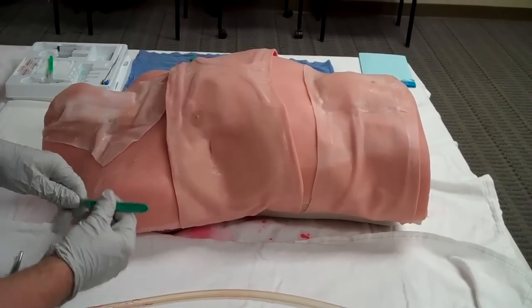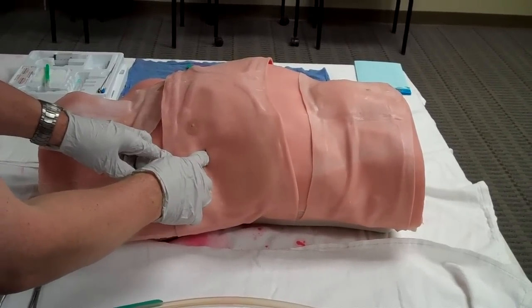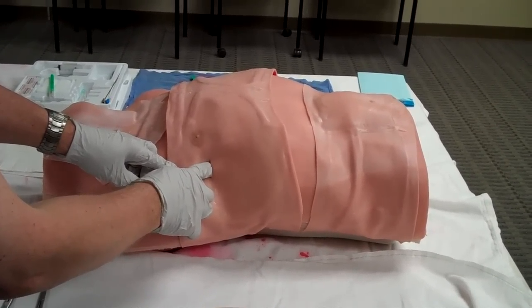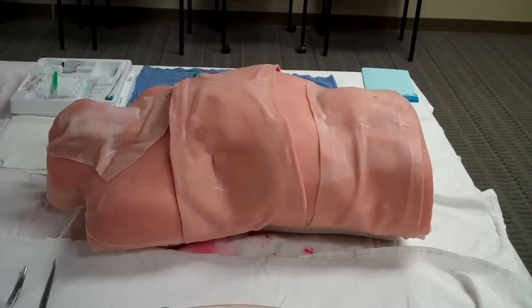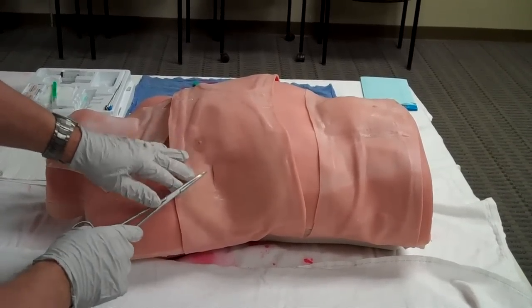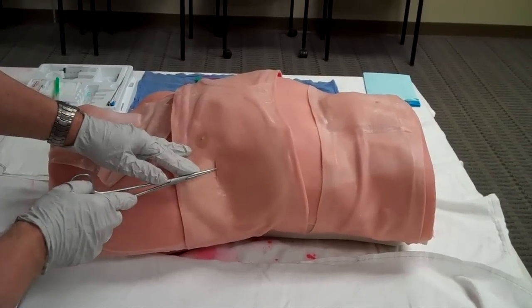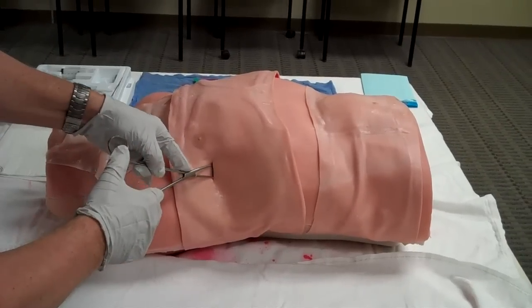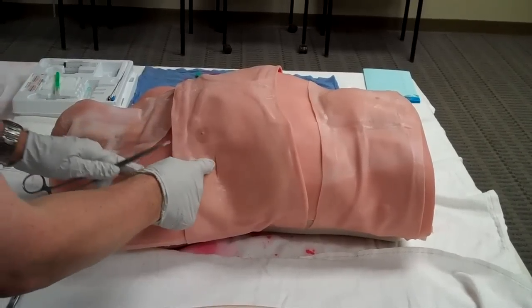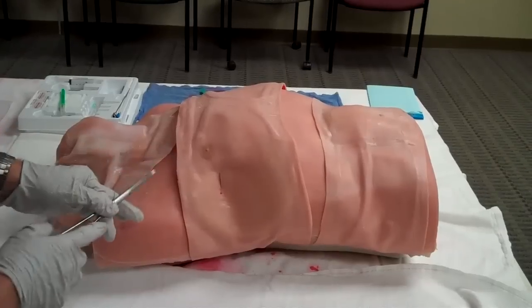Now, the next thing I'm going to do is to actually just feel around. I'll put my finger in so I can feel where the ribs are, because what I would like to do is feel the rib and then go on the rib right below there and just come right over the surface of it. So the next thing that you do is to take a hemostat or a relatively fine-pointed instrument, and in this case, you will poke in and spread a little bit. Come out, poke in deeper, spread, pull out, deeper, spread. You keep on repeating, and if you need to feel where you are, stick your finger in again just to make sure that you're right on the top of that sixth rib, and then continue.